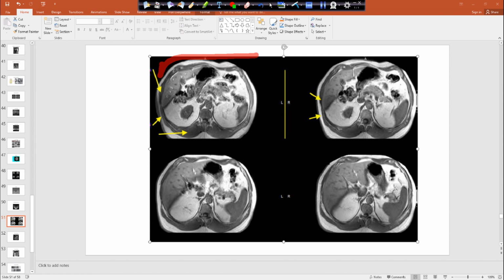It could be as simple as those straps being too tight on this side, and then too loose on that side. So when you put those coils on, make sure it's even. Don't have it looking all wonky and wobbly. Making sure it's very uniform.